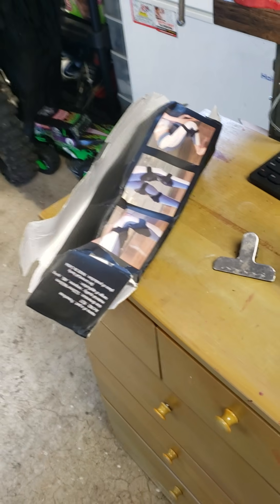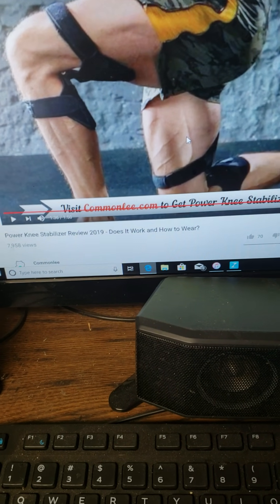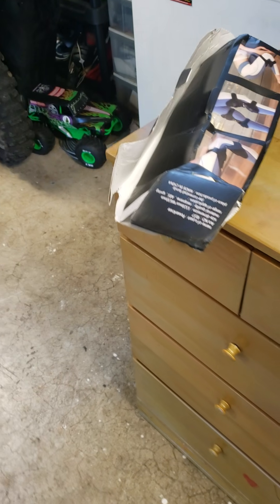Hello YouTube, this is Flots 45. I had a quick review on something. So if anybody is thinking of buying these power knee stabilizers from the company Uplift, I just had a quick review on it.